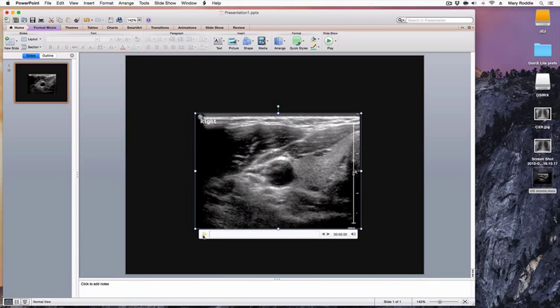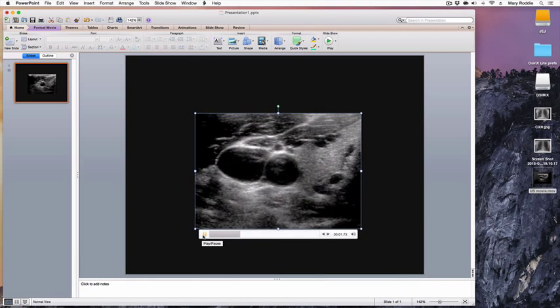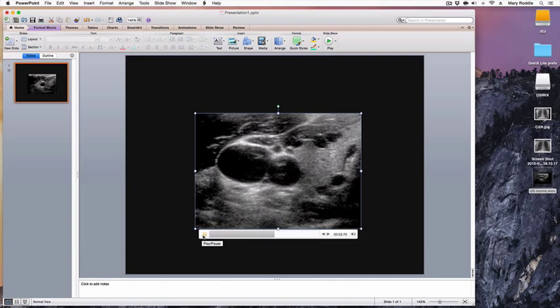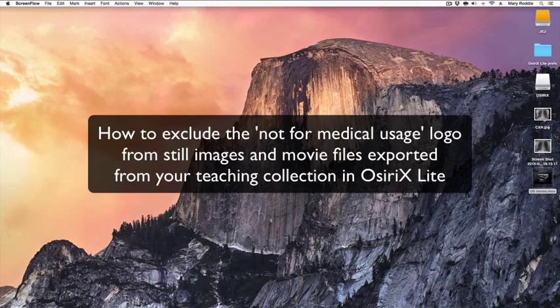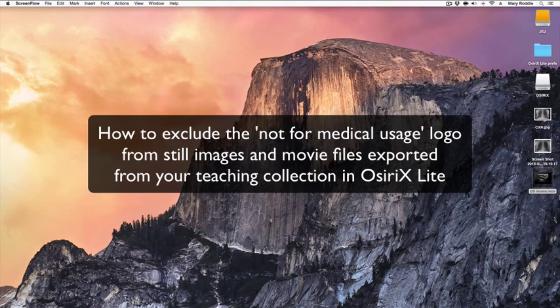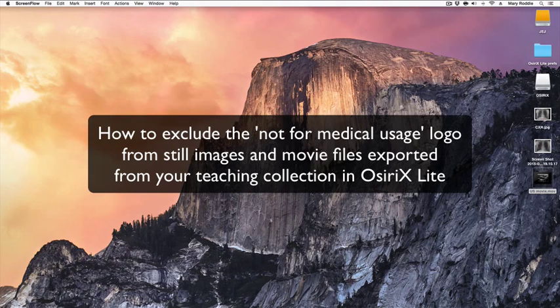I now have a movie clip that will play in a PowerPoint presentation without the 'Not For Medical Usage' logo showing. To summarise, what we've covered in this tutorial is how, if you are using OSIRx Lite to build your teaching collection, you can still export still images and movies to use for teaching purposes without the 'Not For Medical Usage' logo being included. I hope you found that helpful. Thank you very much.